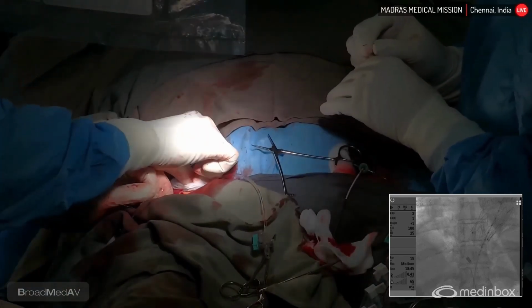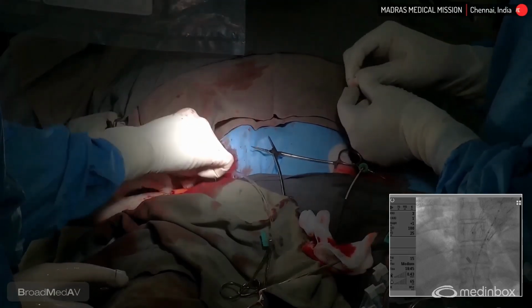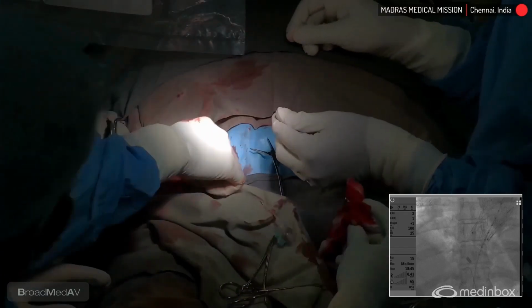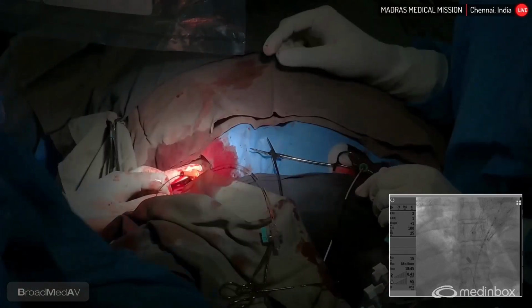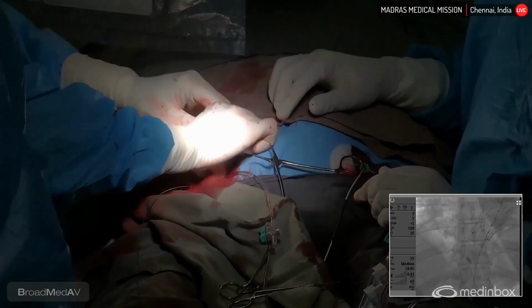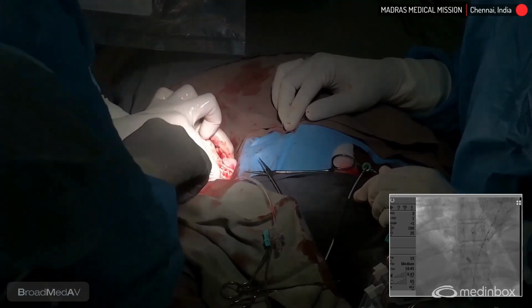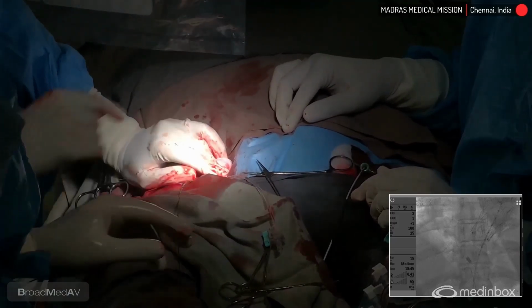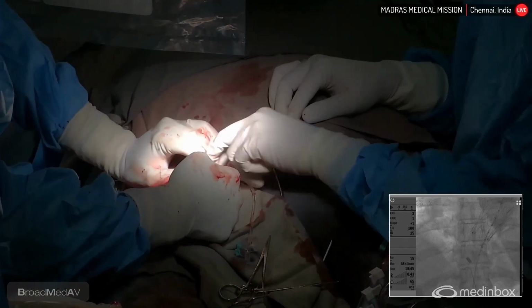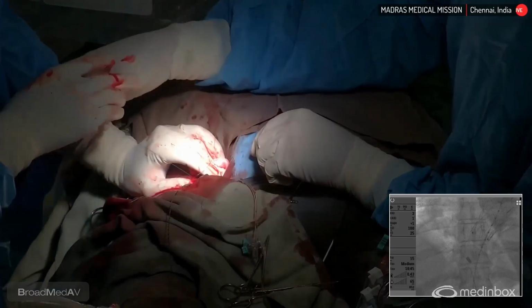Okay, now one of the proglides got cut. So we are going to manage with 2 proglides and 1 angioseal. The 12 o'clock proglide suture wire got cut. Okay, Ashish, can you remove this dilator first? Keep only the sheath. Keep the wire.